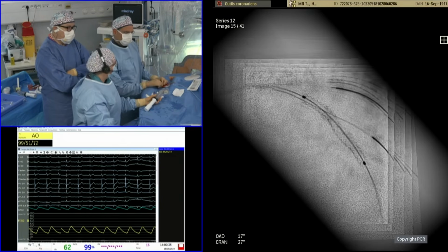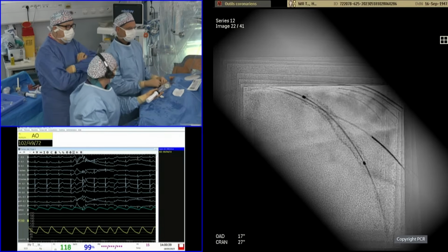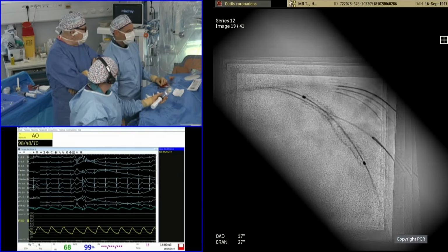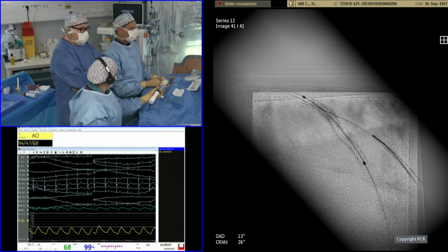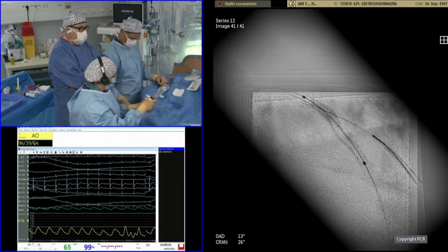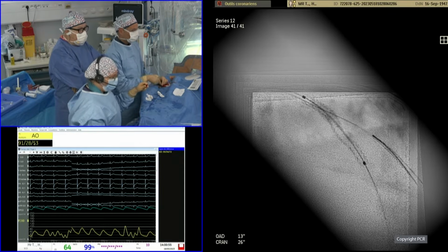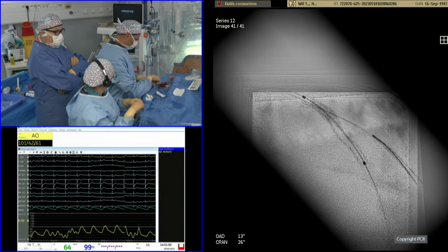Thierry, you are using stent boost now. Can you please help our audience better understand the decision making behind that? Yes, as I said, we use a 2.5 by 28 millimeter Nagomi stent. It was implanted at 14, then we go to 16 atmospheres after first stent boost. We think it's very useful to detect very simply under expansion.